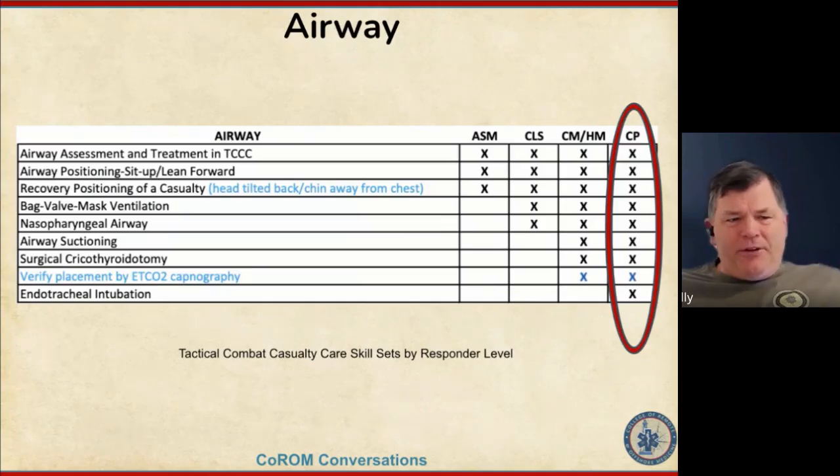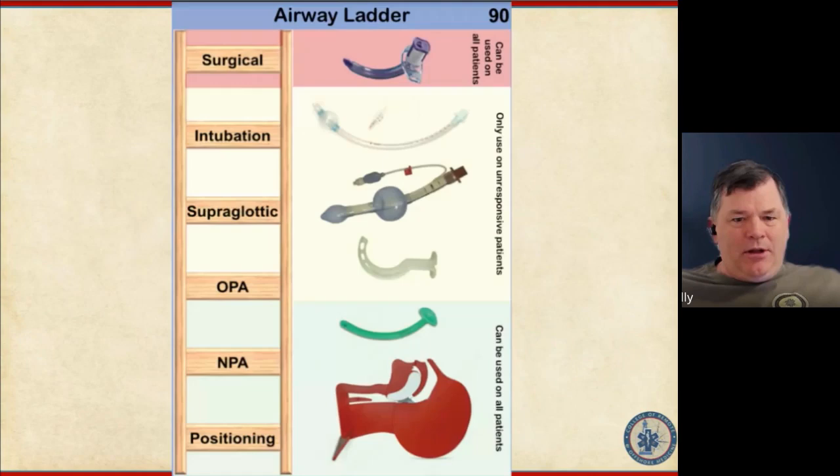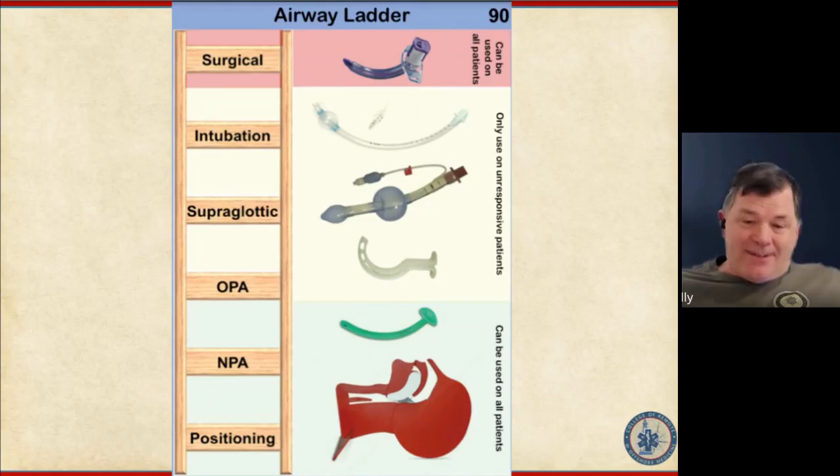The other stuff isn't really cutting edge. We've had this list for a while, and I like to look at it. So it's kind of hodgepodge, and I'm a knuckle dragger, and I kind of like things in a clear and concise way. So I created an airway ladder, and this is what we use at the college to start at the very bottom of your ladder, and you slowly work up until you find something that works.